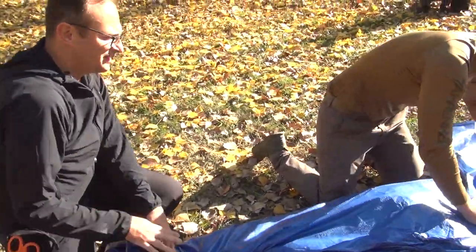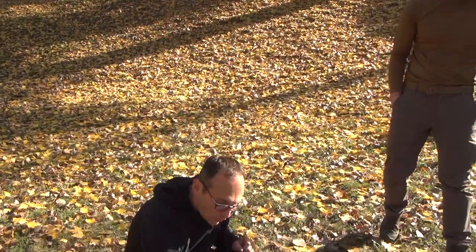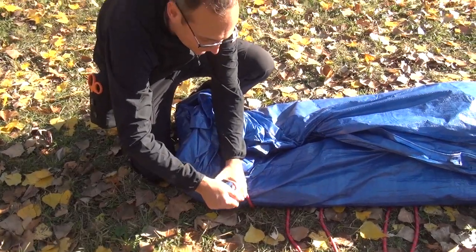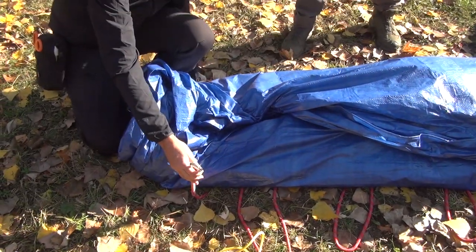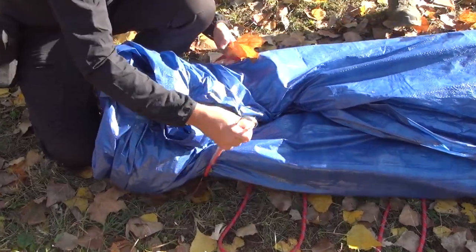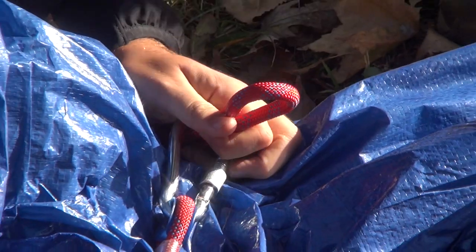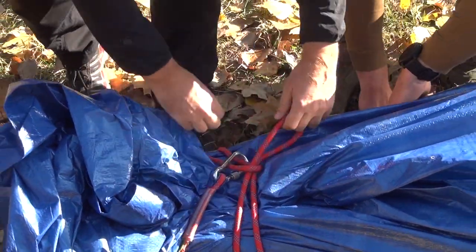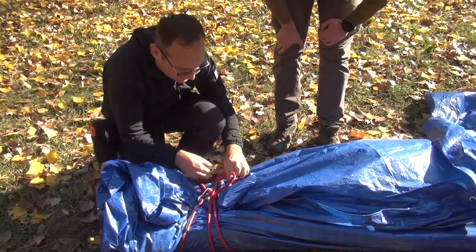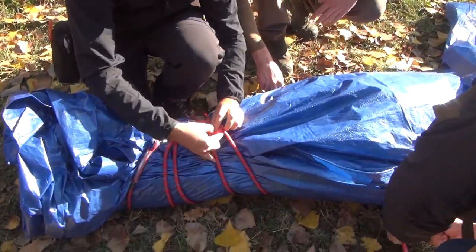Now the most important thing of the litter is to basically make it tight. This rope has nice hooks on the end, but you can also make just a small loop at the end to start off with. So we take the rope here and we pull it from the other side and we push it through like this. Then we take the rope here and we push it through again. And we go again through here. I think I was a little bit too enthusiastic, but it still seems to work.